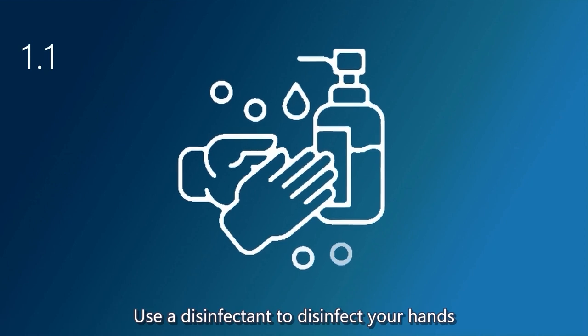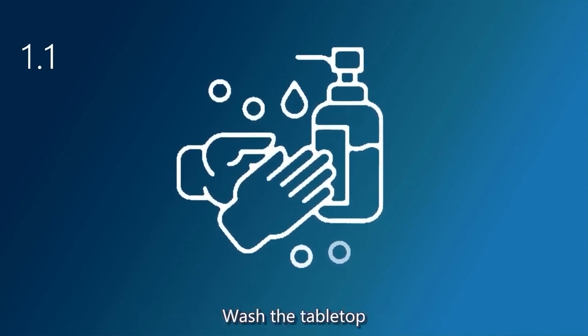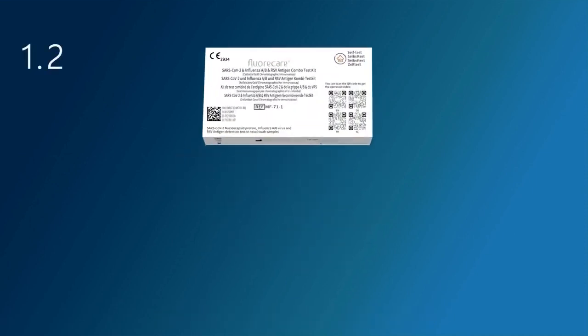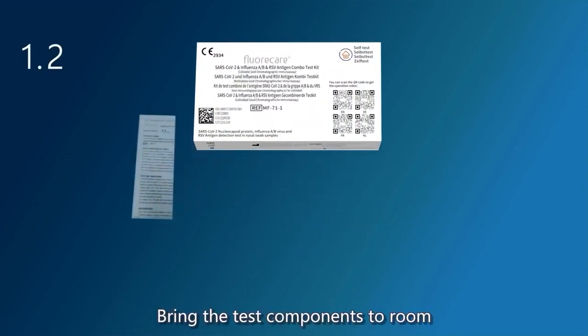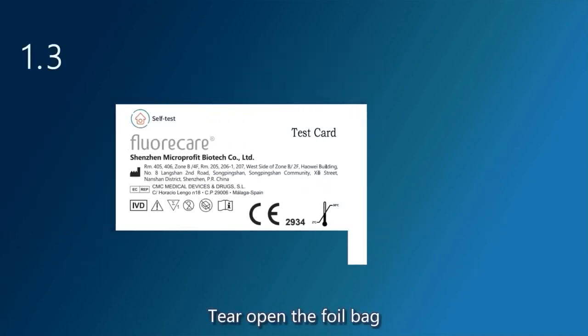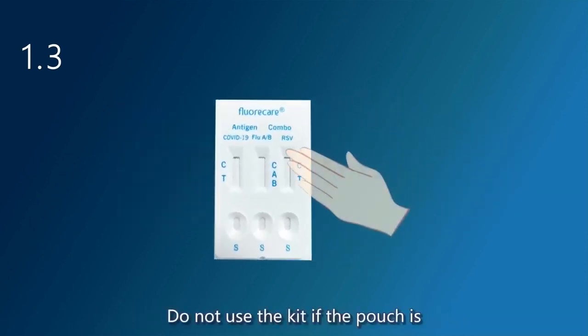Use a disinfectant to disinfect your hands after washing. Wash the tabletop on which the test will be performed. Bring the test components to room temperature, 20 to 25 degrees centigrade. Tear open the foil bag, take out the test card, and use it as soon as possible within one hour.